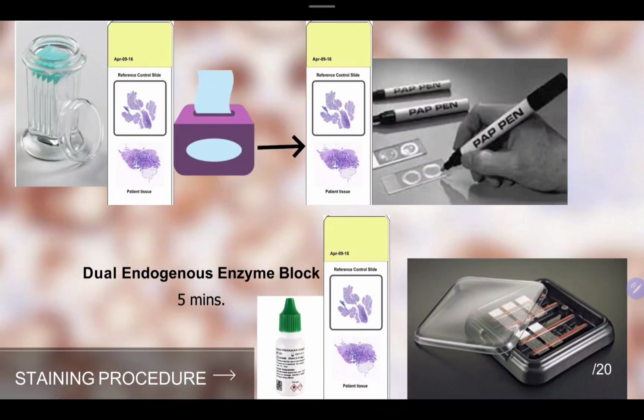After nyan, ito na yung mangyayari. After siya ma-wash, you're going to add Dako pen dito sa gilid niya. Yan, tsak. Tsak. Ang purpose ng Dako pen, guys, na nalagay mo dito, para kahit anong solution po ilagay ninyo dito, magstay lang po siya sa loob para hindi siya maglabas.